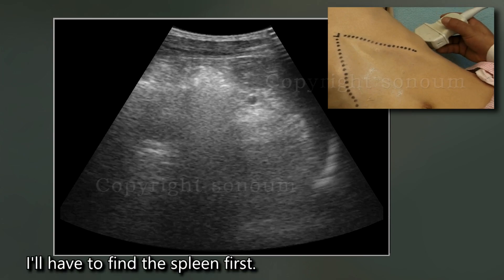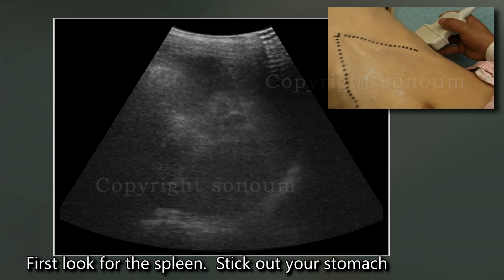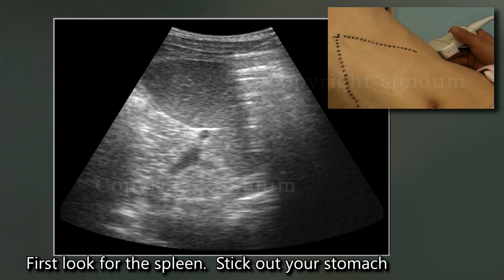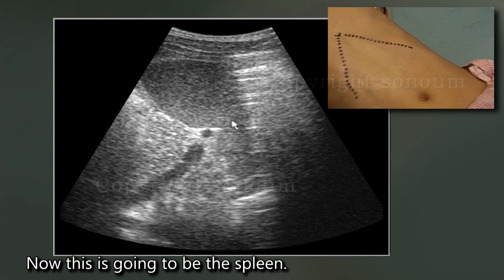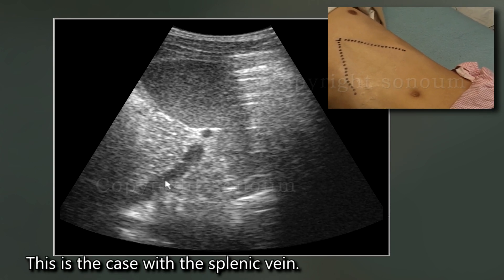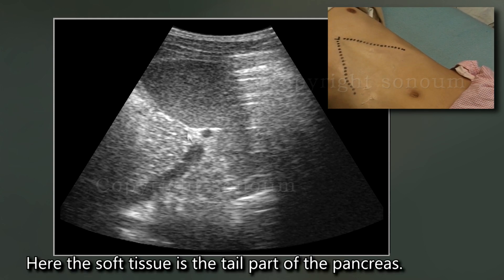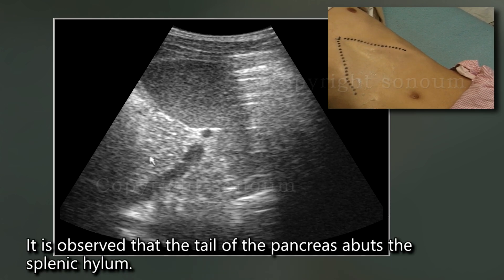First, find the spleen. Ask the patient to stick out their stomach. This is going to be the spleen, and this is the splenic vein. Anterior to the splenic vein is the pancreas — this soft tissue is the tail part of the pancreas. It can be observed that the tail of the pancreas abuts the splenic hilum.